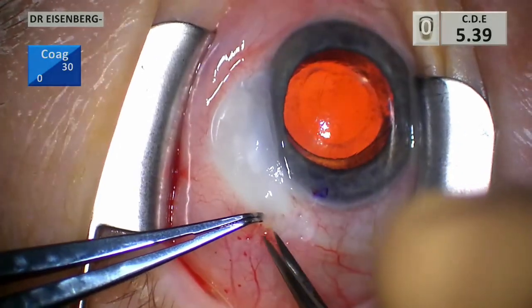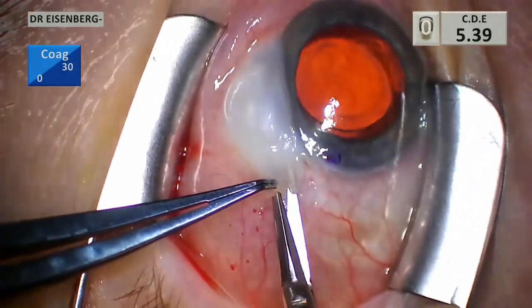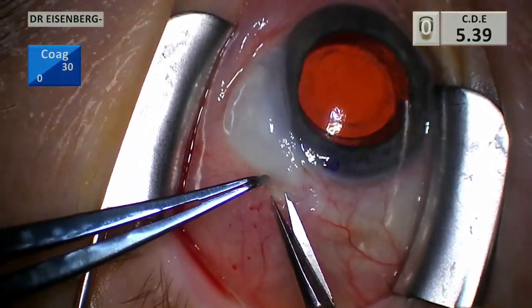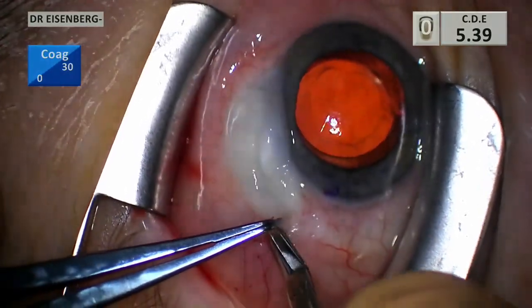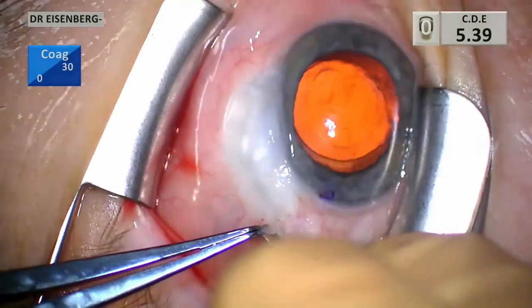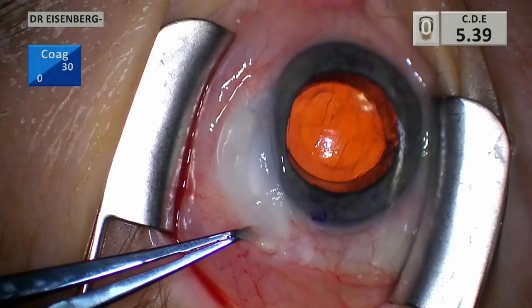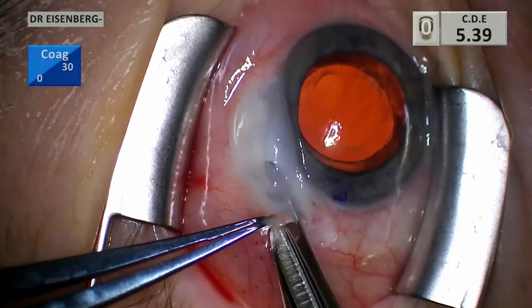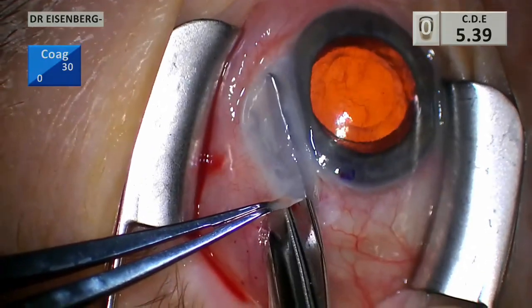Here I am making the radial cautery — that's not my normal cautery tip; we didn't have the eraser tip that day. Then we go in adjacent to the bleb, so I'm working in good tissue that has nice vascularity, and I'm going to undermine into the ischemic tissue. Here I am breaking up that ring of steel — the fibrotic band that delineates the bleb.